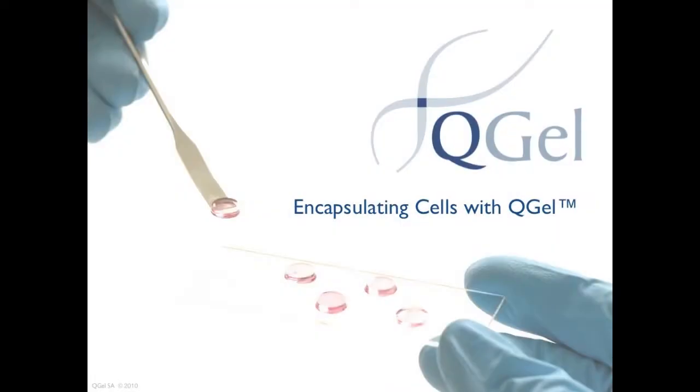QGEL MT3D Matrix is a ready-to-use lyophilized powder containing pre-mixed components. In this short video, we demonstrate how to encapsulate cells in QGEL in three simple steps.